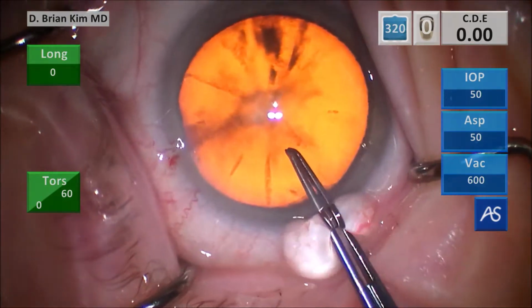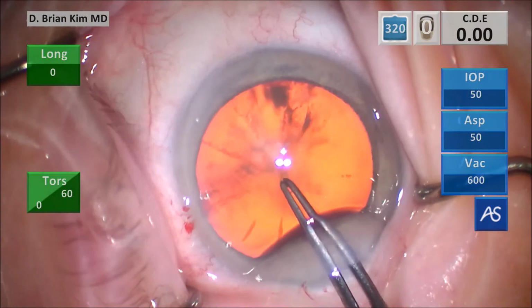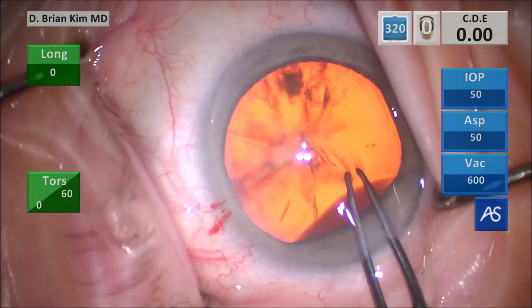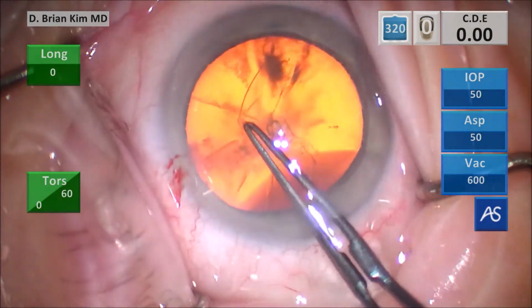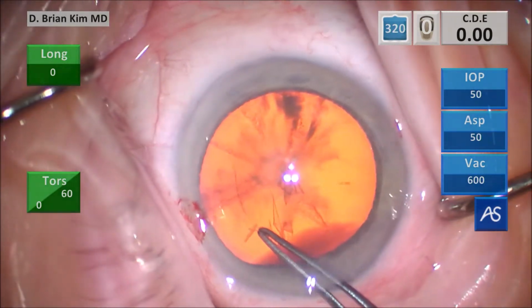Put the forceps sideways, go in, puncture the center, pull down towards me, grab the right side of the tear, and where you grab the tear will dictate the diameter of the rhexis. Go around circumferentially.